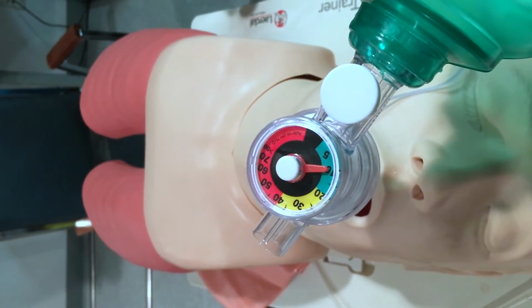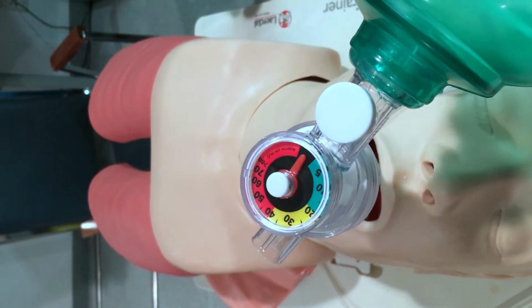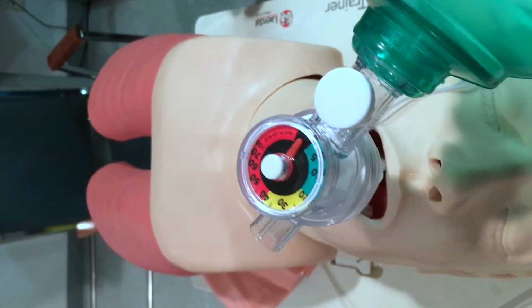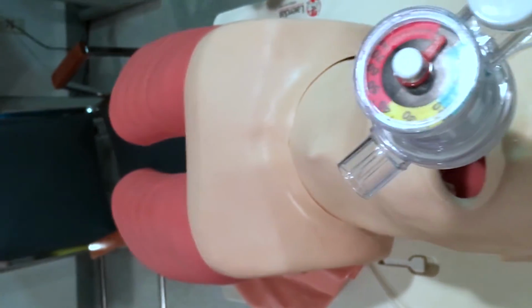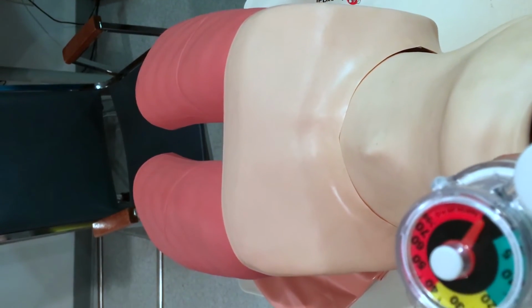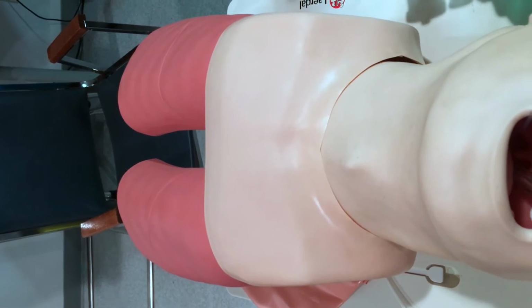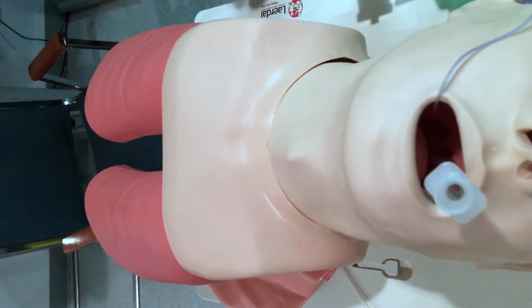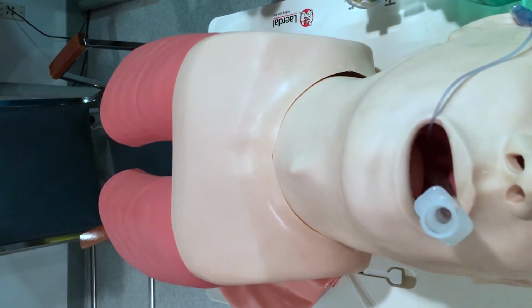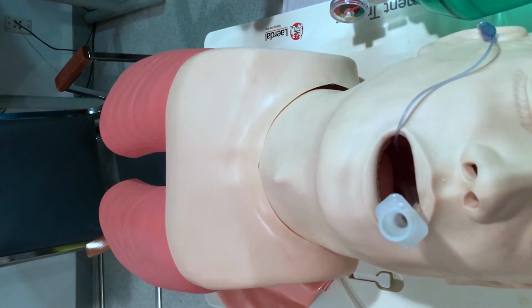The right lung is inflated and the left one is not. It's easier with our anatomy to do a right main stem intubation just because it's more straight versus the left lung intubation. So you want to identify the depth of the ET tube and evaluate peak airway pressure.